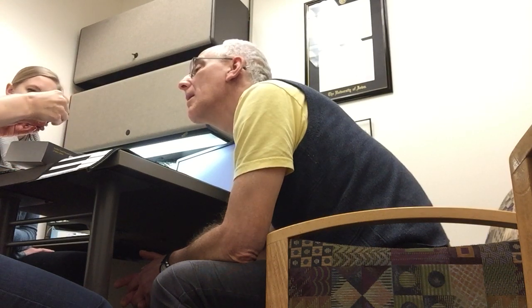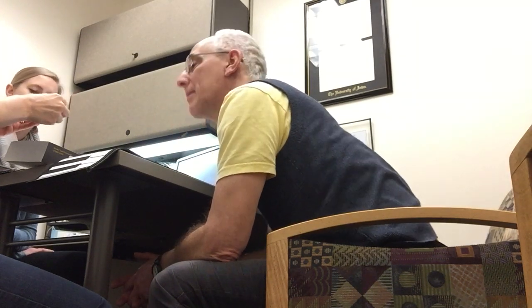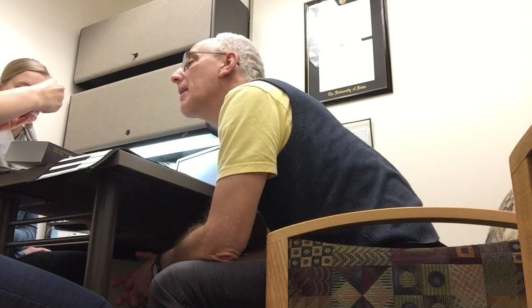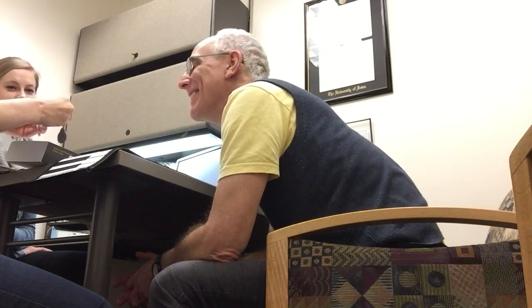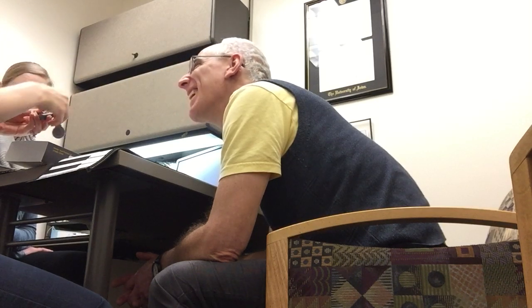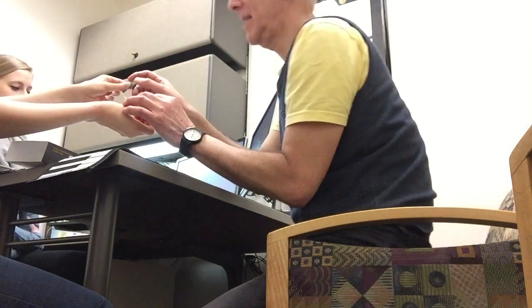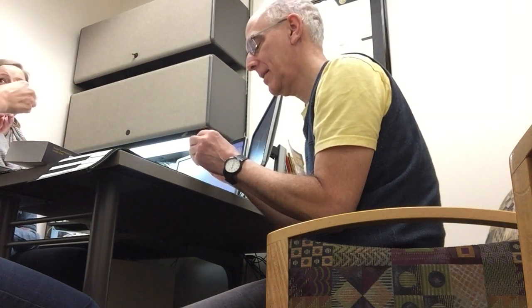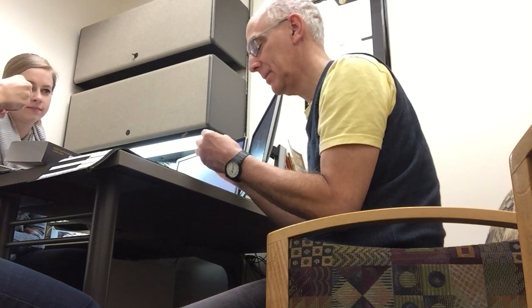So this goes inside of here and it only goes one way. If you're having a hard time, it just needs to be switched around. Getting this apart is not easy until you have it connected, and then it's much easier to pull them apart. I wouldn't recommend trying that way. Do you want to practice? Make sure you feel comfortable with that. Perfect. Very good.